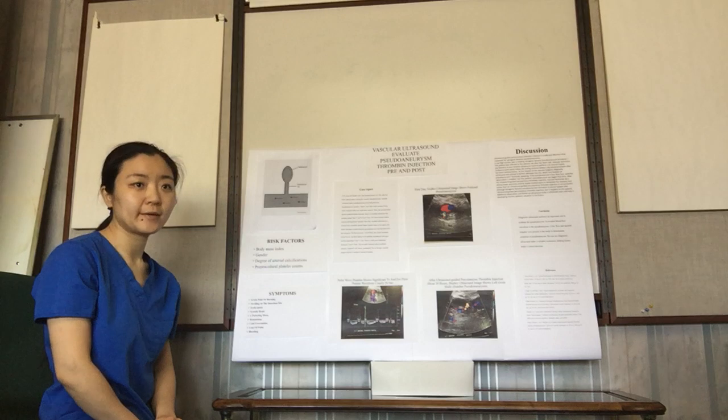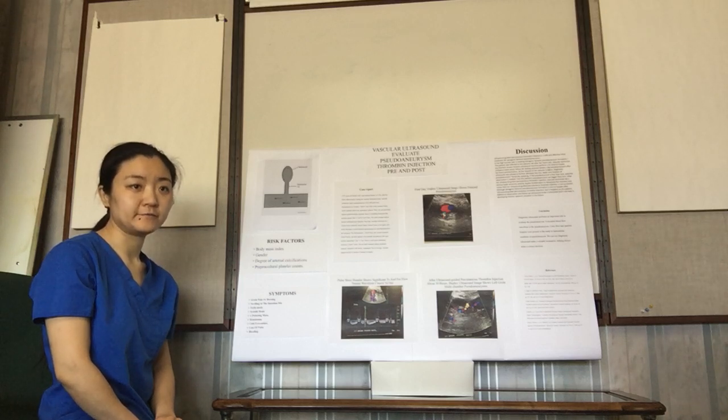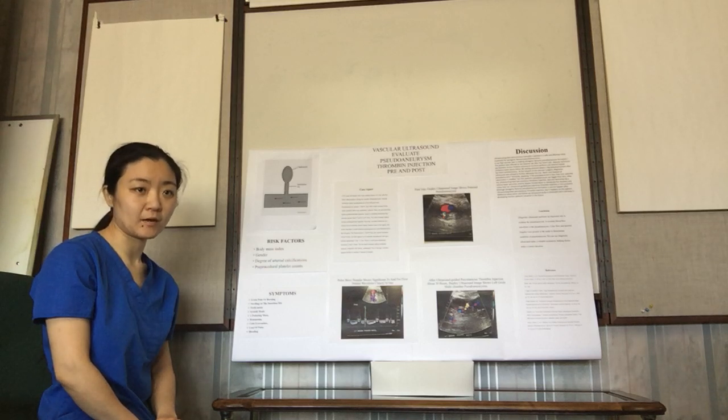I have 5 questions about my study. The first is, do you know what the risk factors of pseudoaneurysm are? The second one is, can you tell me 3 symptoms of pseudoaneurysm? The third one is, do you remember if a pseudoaneurysm is less than how many centimeters, we only need to observe it? The fourth question is, do you know the typical pseudoaneurysm pulse wave Doppler waveform?